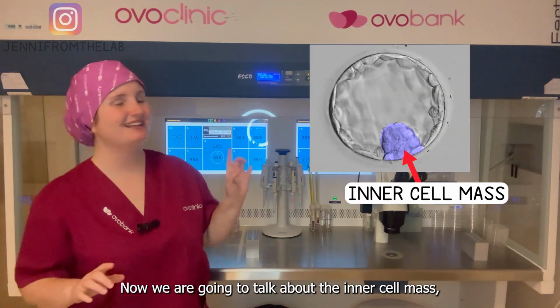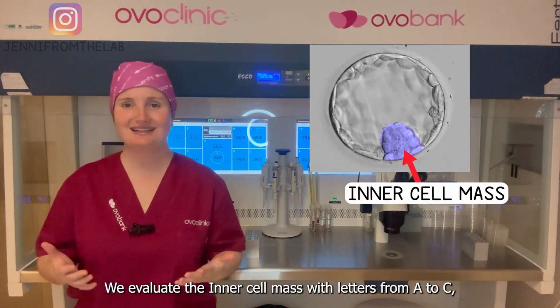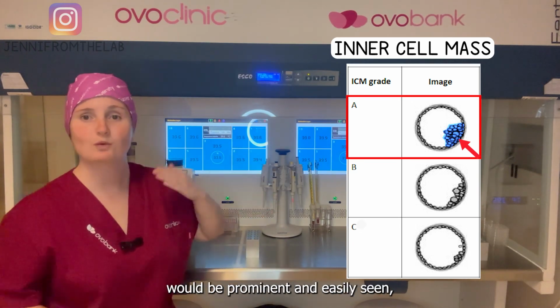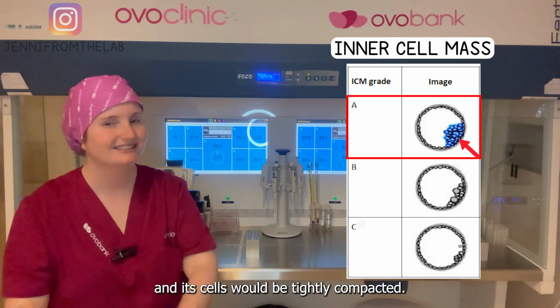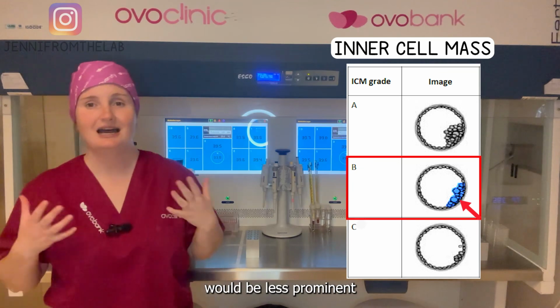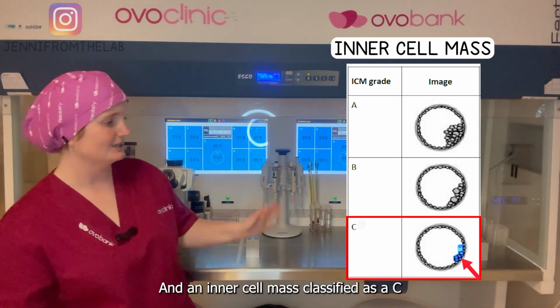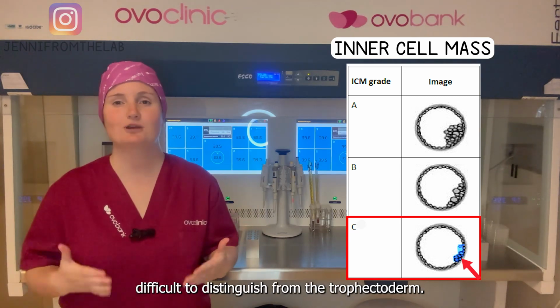Now we are going to talk about the inner cell mass, the structure that will eventually become the baby. We evaluate the inner cell mass with letters from A to C, with A being the best. An inner cell mass classified as an A would be prominent and easily seen, and its cells would be tightly compacted. An inner cell mass classified as a B would be less prominent, and its cells would be less compacted and also larger in size. And an inner cell mass classified as a C would have very few visible cells, and those cells would be difficult to distinguish from the trophectoderm.